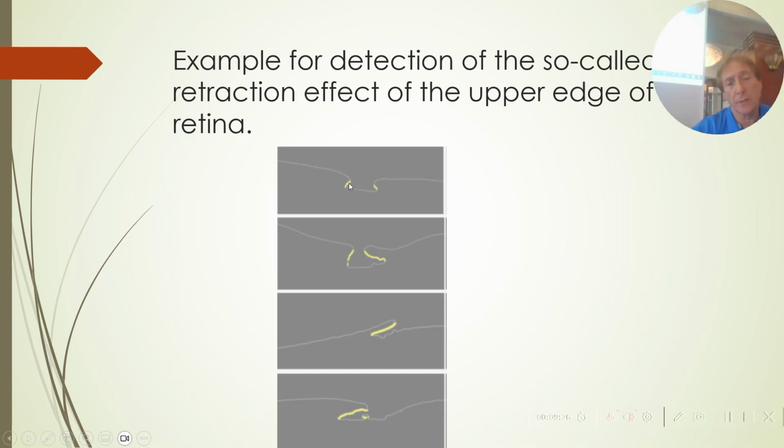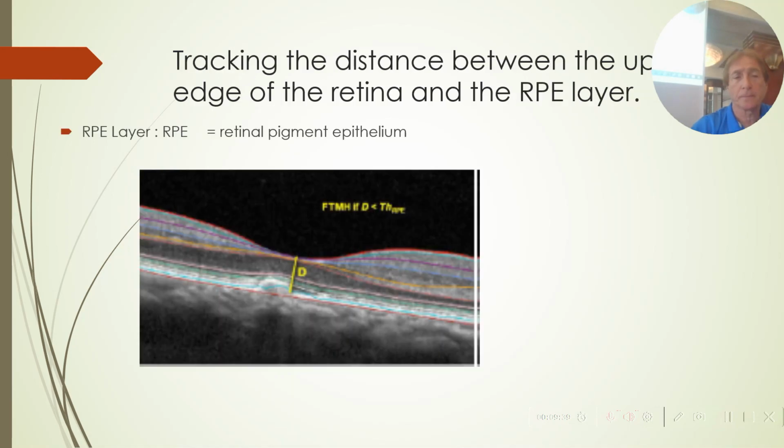It means it goes in the other direction, and this is also a sign for us that we have a pathological case.